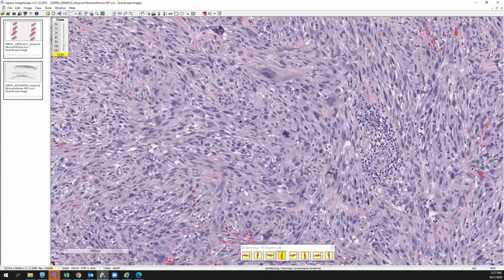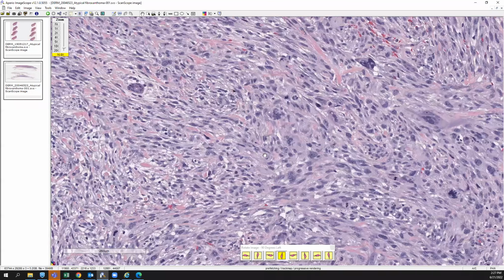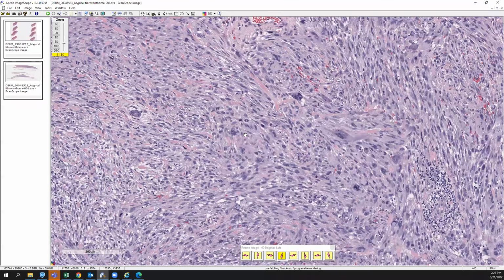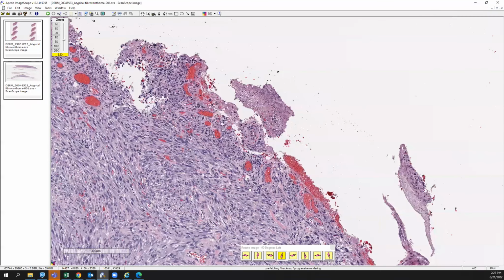And you can see scattered mitotic figures in this example. You can see that they've got a lot of nuclear pleomorphism. The background has kind of grayish to amphophilic cytoplasm here. Oftentimes they're ulcerated on the top with some acute wound healing, granulation tissue with neutrophils, inflammatory crust, et cetera. But the action is in the dermis.